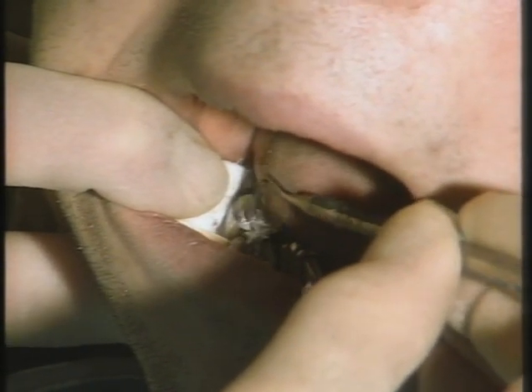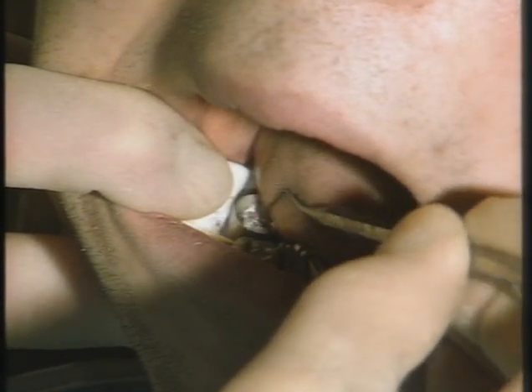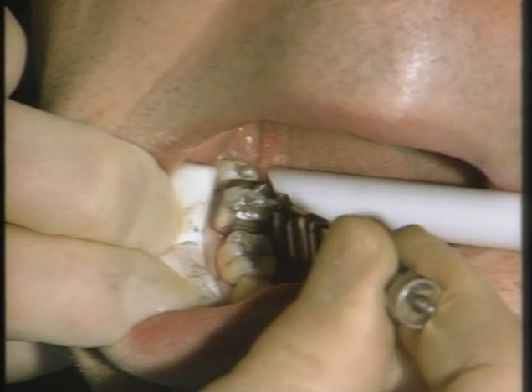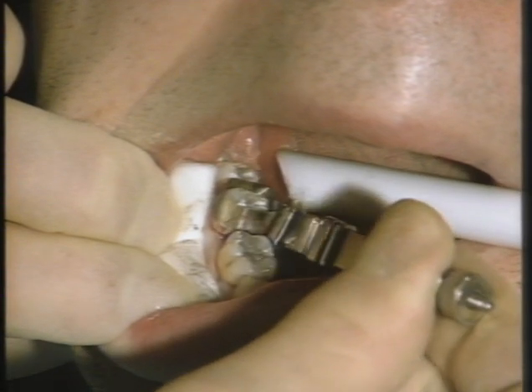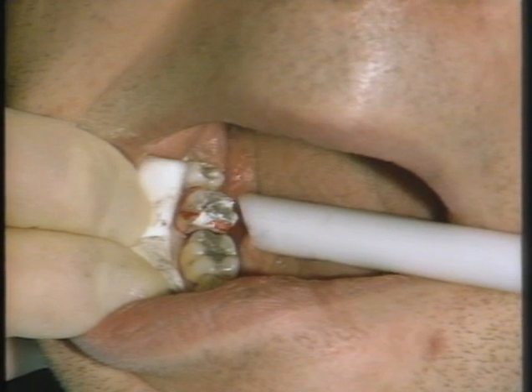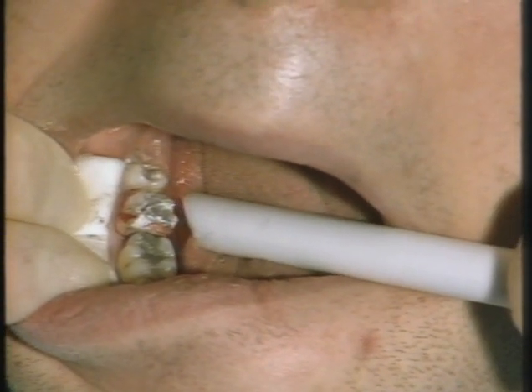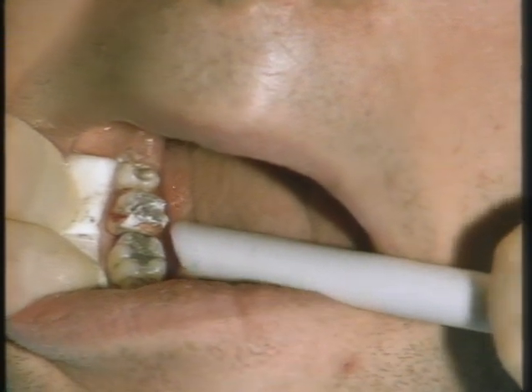Amalgam debris like this is not very nice stuff to have in the floor of the mouth. And I see the tongue is interfering with the dentist there. The blood that's associated with that tooth can be seen very clearly, and of course this will tend to occlude vision when it comes to carving interproximally and so on.